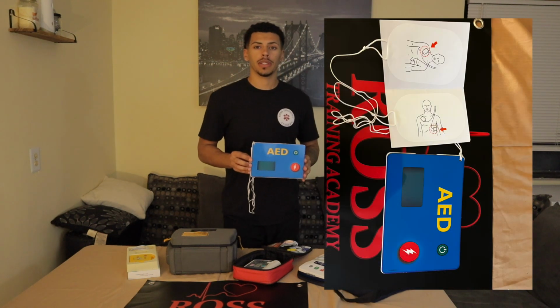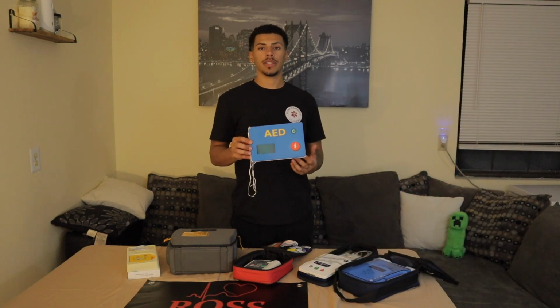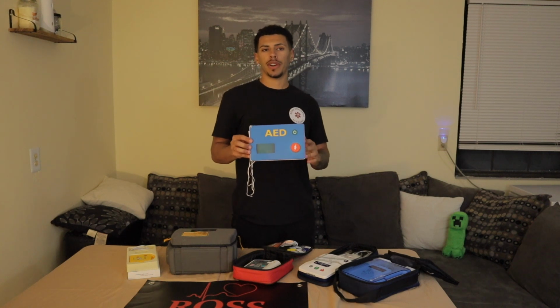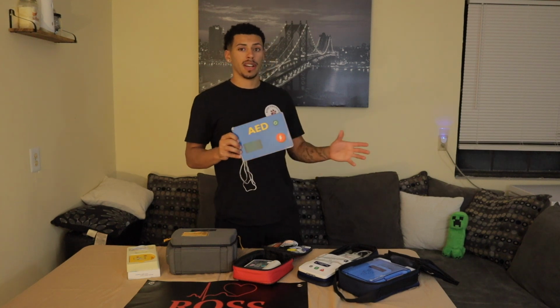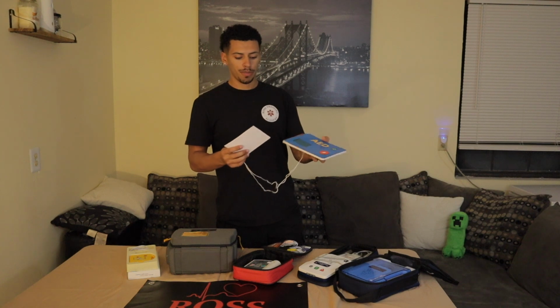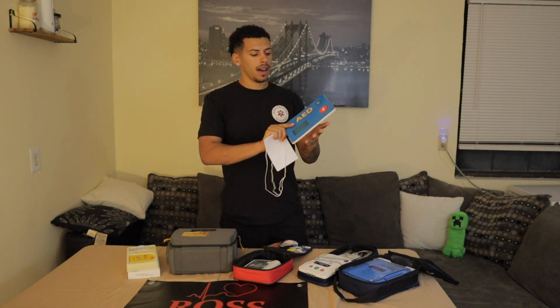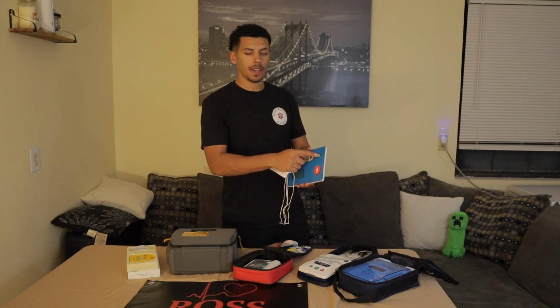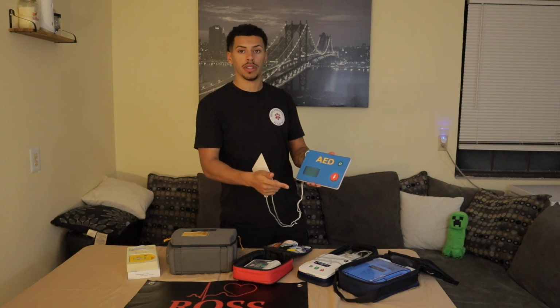The first one we're going to look at is one that comes with the inflatable CPR mannequins that you can buy from the AHA website. This is just going to be free. It comes with the kit. It's a foam piece with some string and little paper AED pads. It just says AED on the top. There's no batteries, it doesn't turn on, it doesn't do anything. It just has a fake printed on button and a printed on shock button as well.